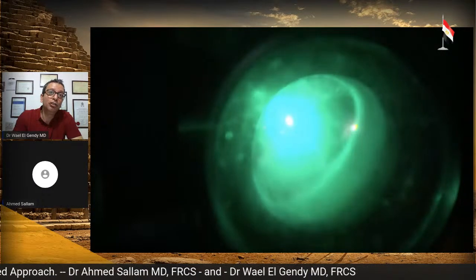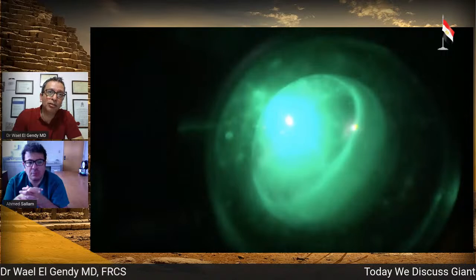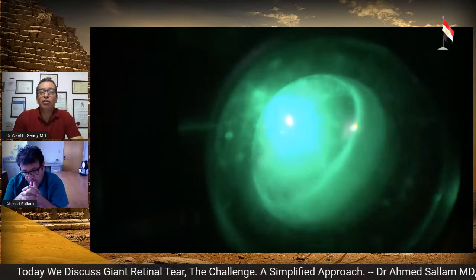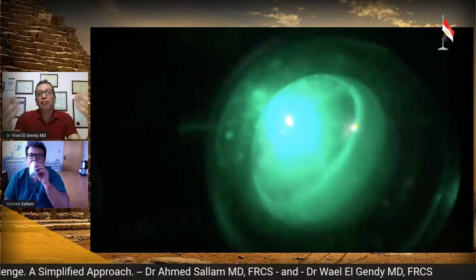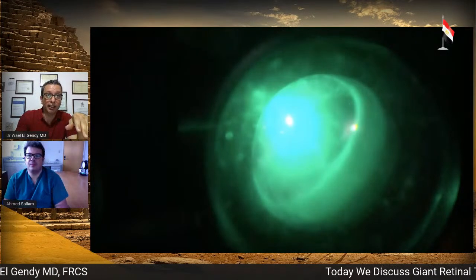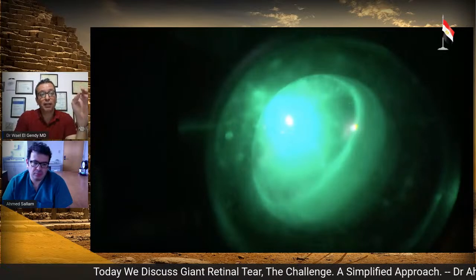So in order to have the retina coapted on the choroid and the retinal pigment epithelium, and get your laser to mark, you can use several tricks, like Dr. Ahmed Sallam said. First, you can tilt the eye towards you so that the PFC is covering the horns itself, and then you start the laser.